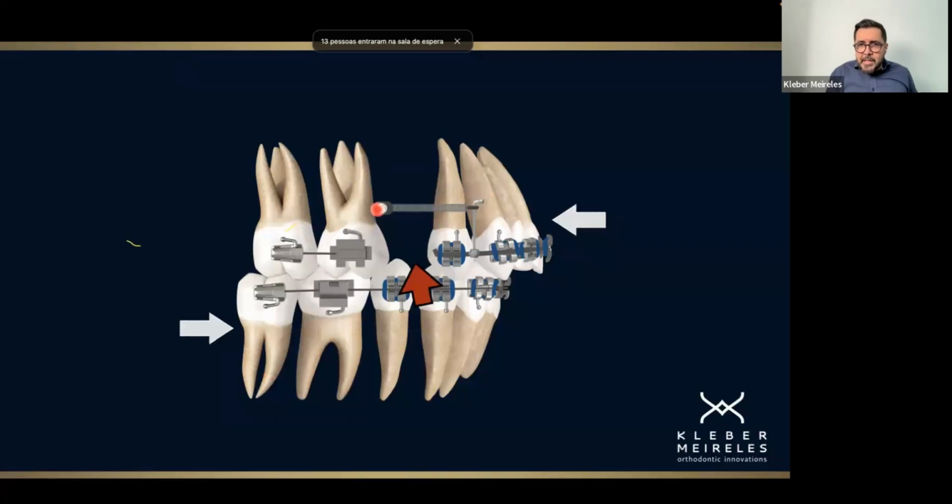When you apply the line of action of the force to move one body, the type of movement will be related to the center of resistance of that body. So now I'm moving the body distally using the line of action of the force passing through the center of resistance. So why do I need the ligation between the anterior and posterior segment for that?